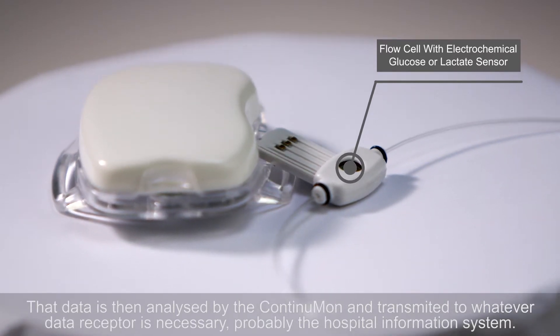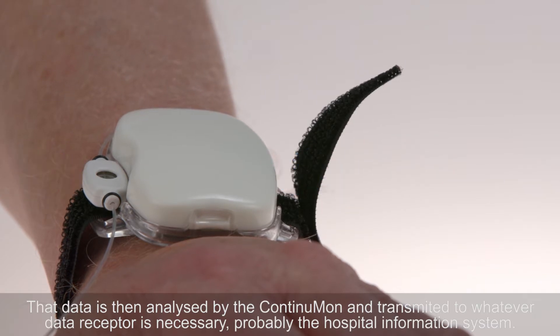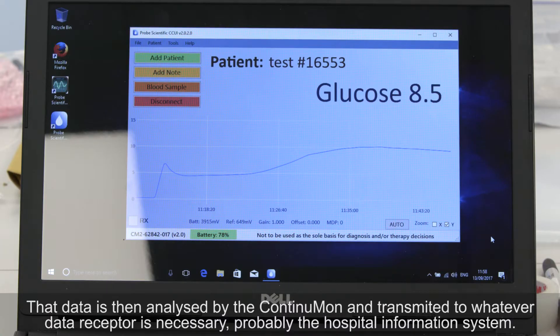That data is then analysed by the ContinuMon and transmitted to whatever data receptor is necessary, probably the hospital information system.